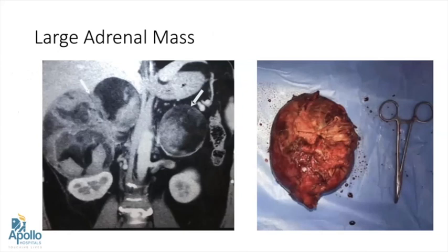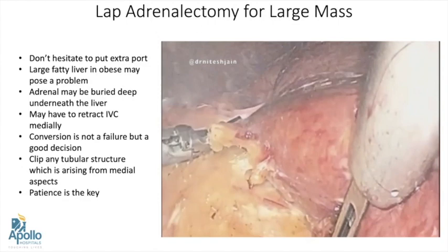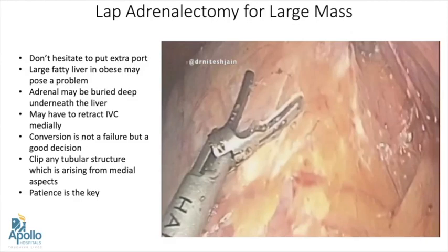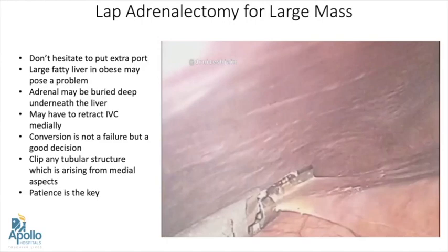My next index case is a large adrenal mass. This patient was having bilateral adrenal mass and underwent bilateral adrenalectomy, but here I will be discussing only the right hand side. It was around a 17 centimeter mass. In case of large masses, we should not hesitate to put an extra port. A large fatty liver — especially in obese patients, many of whom can be very obese, particularly with myelolipoma — can pose a problem because of difficult retraction, and the liver can be very heavy and may need one more extra retraction port. The liver needs to be mobilized aggressively.